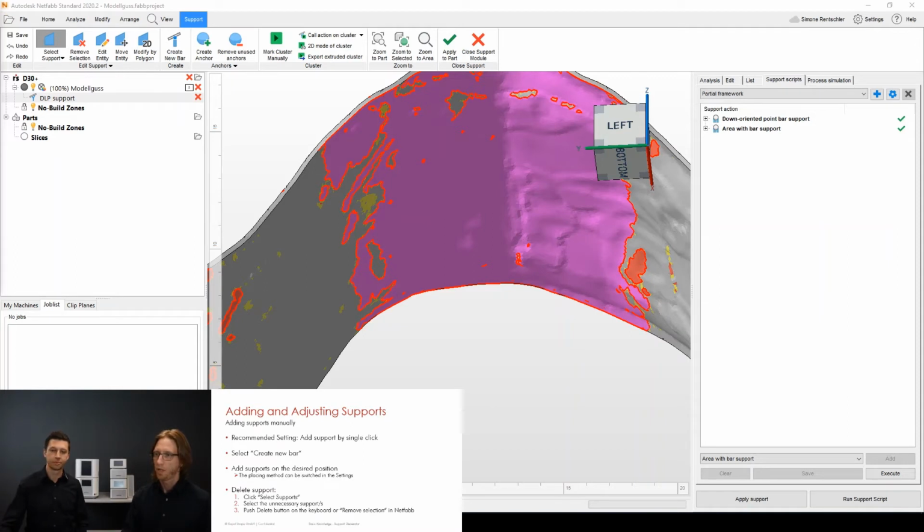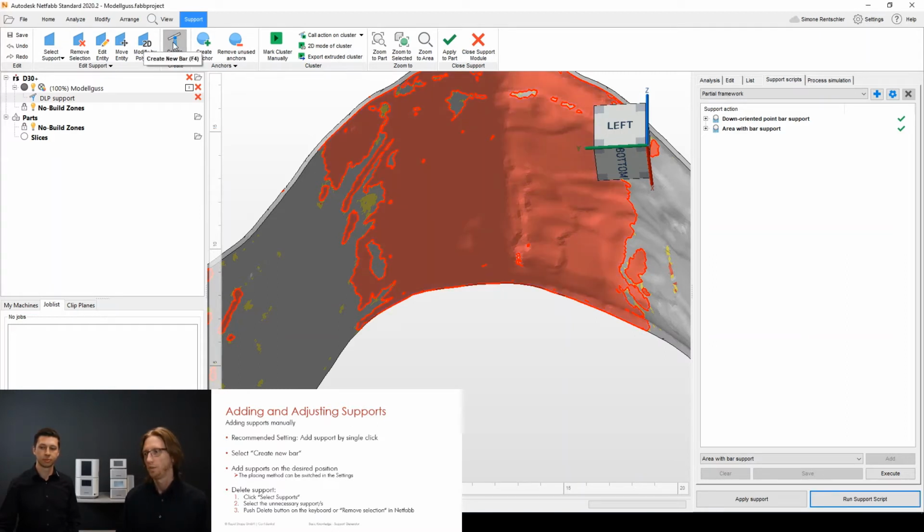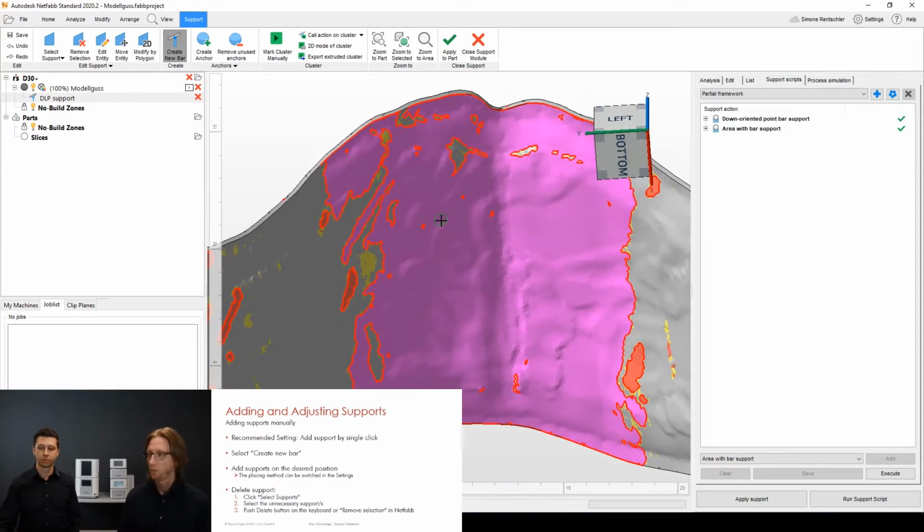This can be quite difficult to do in the beginning because, let's say, the default settings in NetFab are not very user-friendly, and there's a way to make this a little bit easier for the customer and for you guys. So first thing we need to know is which button do I have to press in order to be able to add a new support, and this would be the create new bar button on top in the bar here. So what you do is you would just select the area you want, and you would perform in the default setting a double click.